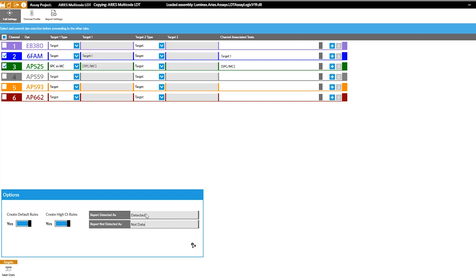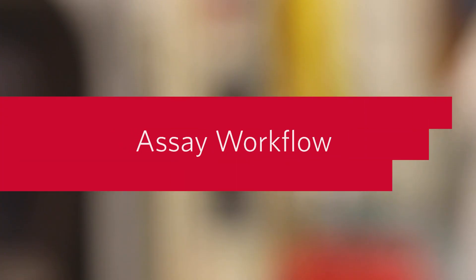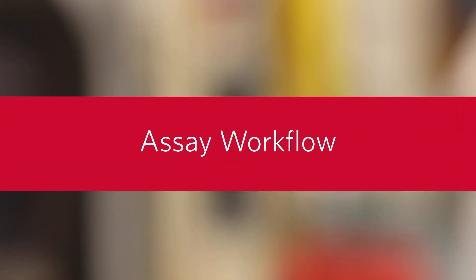Once you save the new assay file, export it to a thumb drive or network folder and then import it onto your Ares system. Now we'll review the assay workflow.